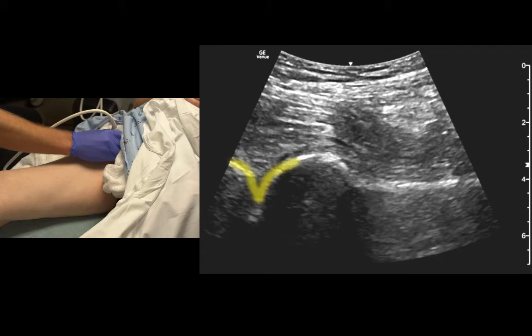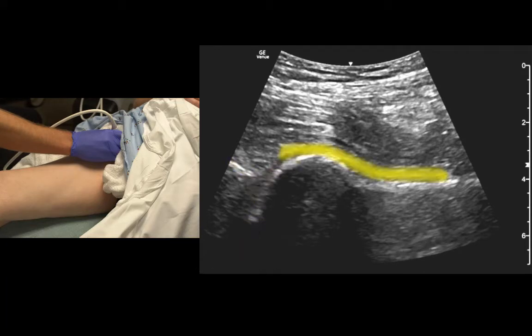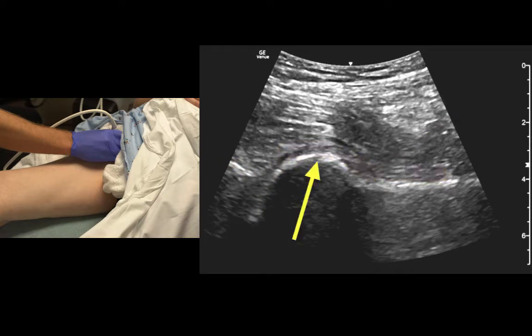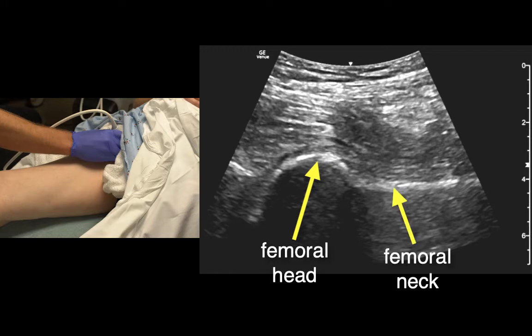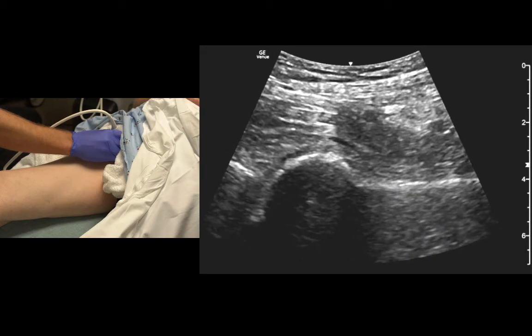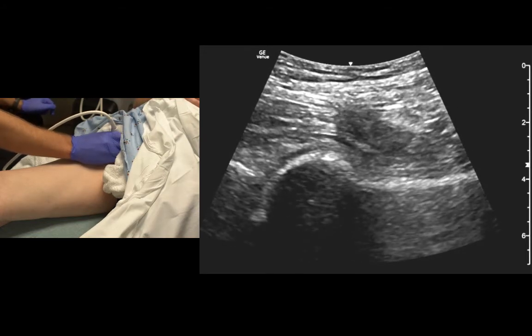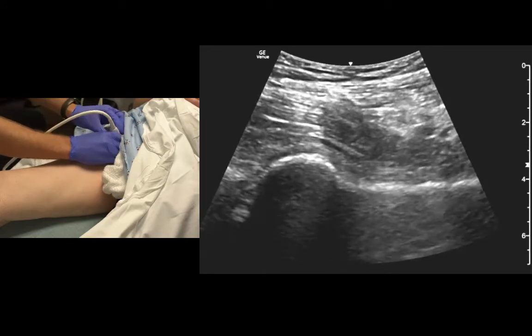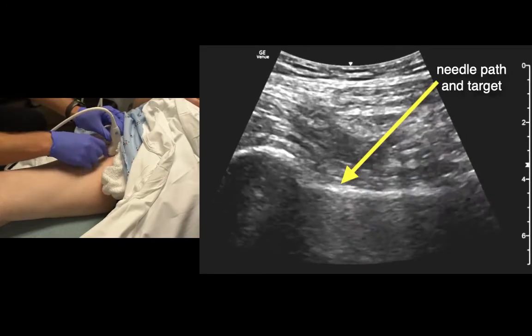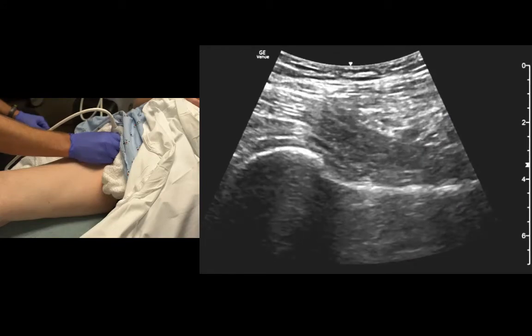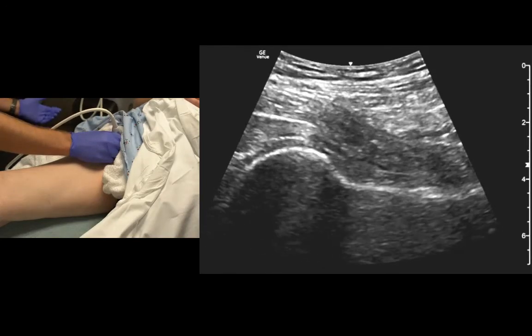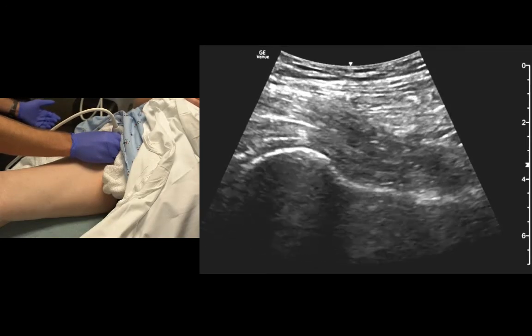The joint space is up top, but the synovial capsule extends all the way down to the femoral neck. Above the femoral neck is where we look for abnormal fluid, and if we were going to tap it, we could guide our needle just like this. That's really it for the hip — pretty straightforward. There's obviously no fluid here.